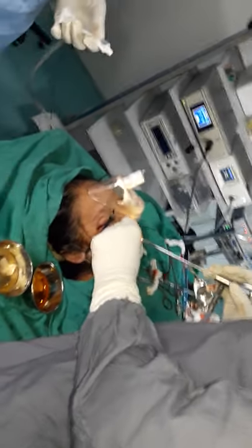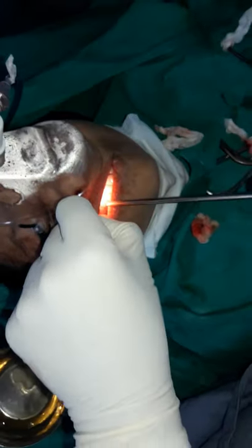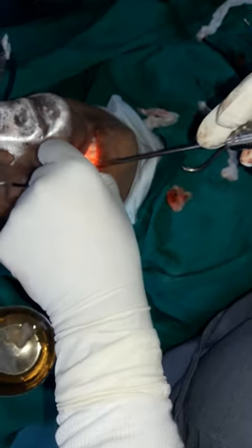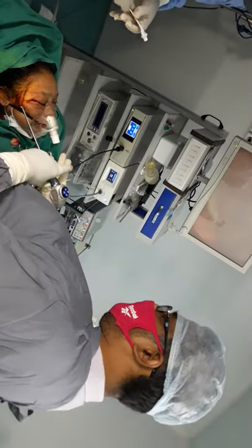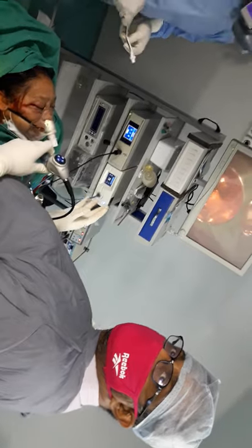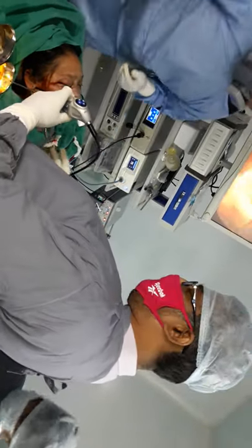Inside, the Caldwell-Luc procedure was done. Through this I removed the maxillary pathology. Simple surgery — under local anesthesia we did this whole procedure in less than one hour. There is absolutely no complication of general anesthesia, with the lung already compromised due to Covid. So this approach is always better.